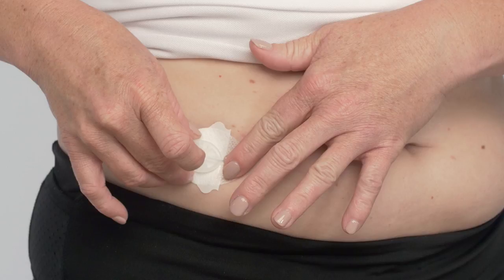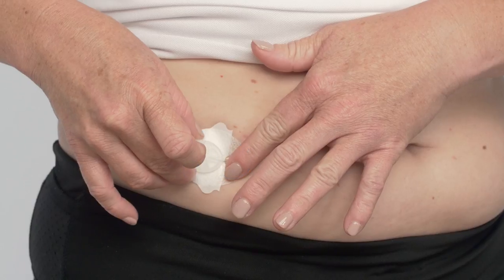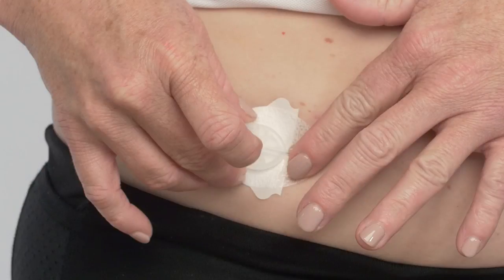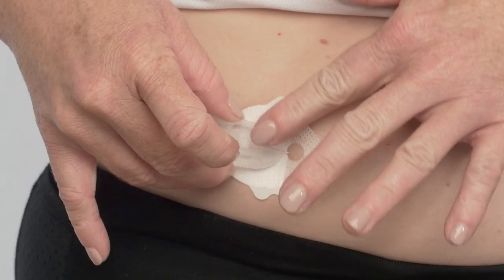Next, remove the introducer needle. Place one finger in front of the clear window. Squeeze the sides of the introducer needle with the other hand and pull the introducer needle straight back. If you experience difficulty removing the needle, you may be pressing on the needle with your forefinger. Try straddling the needle with two fingers to secure the adhesive tape while you're pulling the needle out.